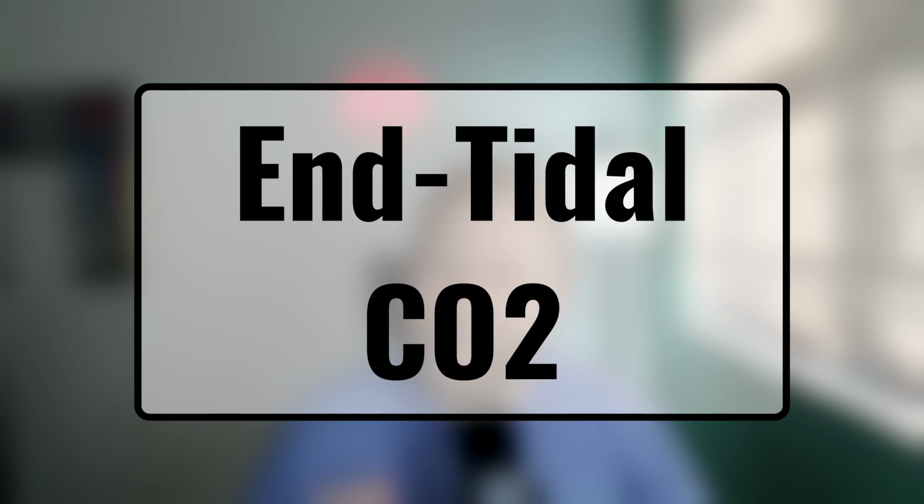This number will tell you if your patient is about to die before any other vital sign. Let's talk about end-tidal CO2. So what is end-tidal CO2? Well, it's the amount of carbon dioxide measured at the end of exhalation.